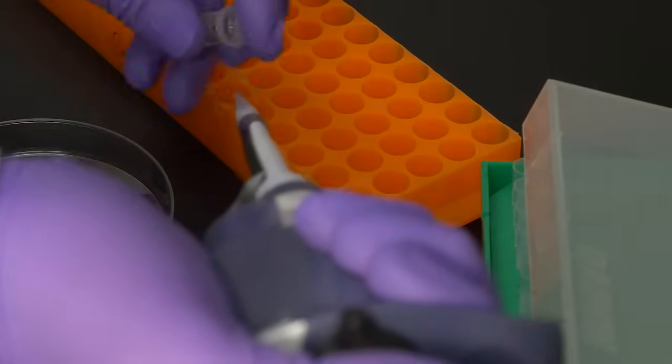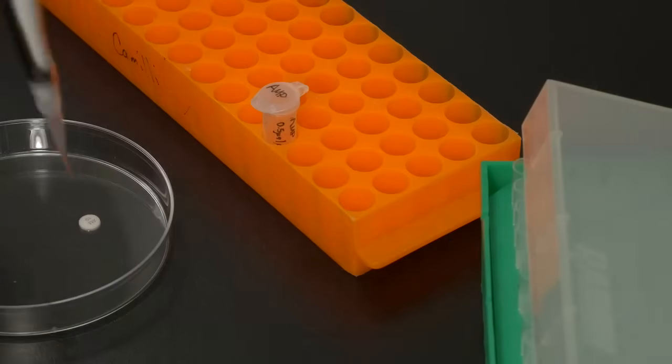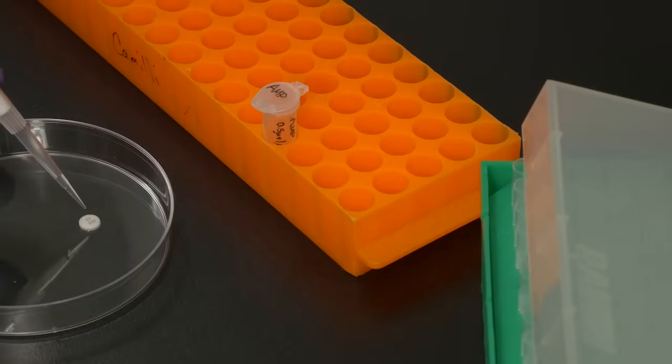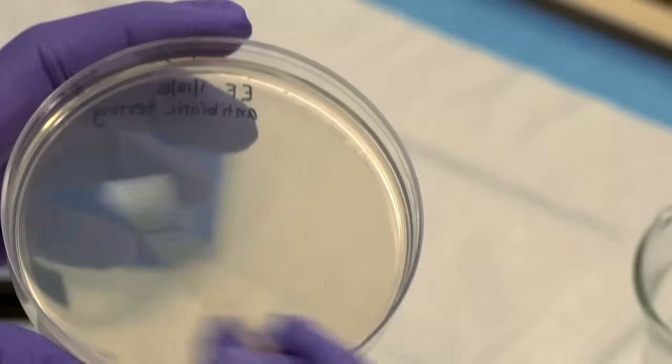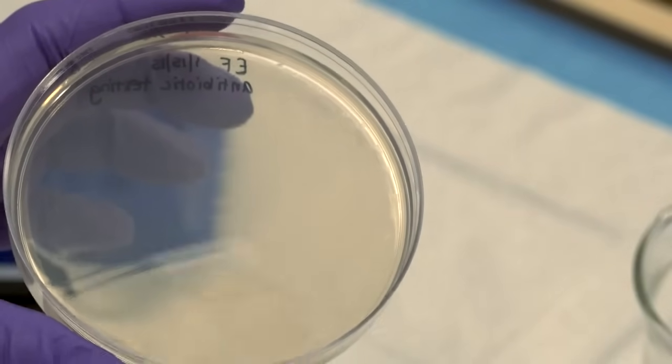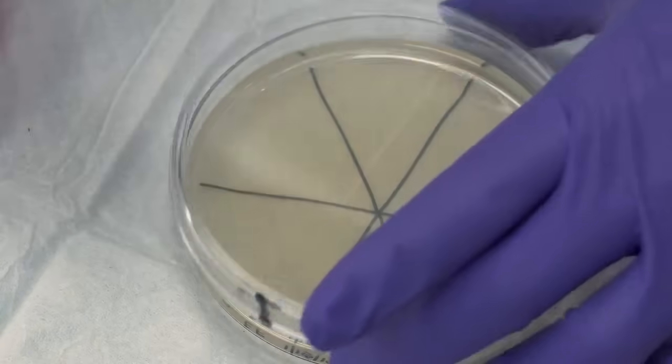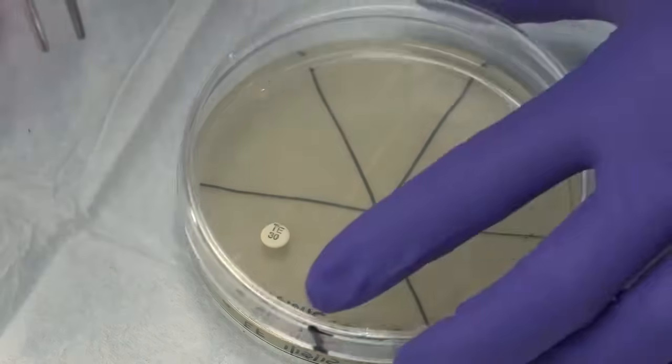We use little paper discs that are soaked in antibiotic. Generally, scientists buy these discs already soaked in the antibiotic. We take the discs and put them on a petri dish that is thick with bacteria. The antibiotic diffuses into the agar while the plate is incubated and stops growth.